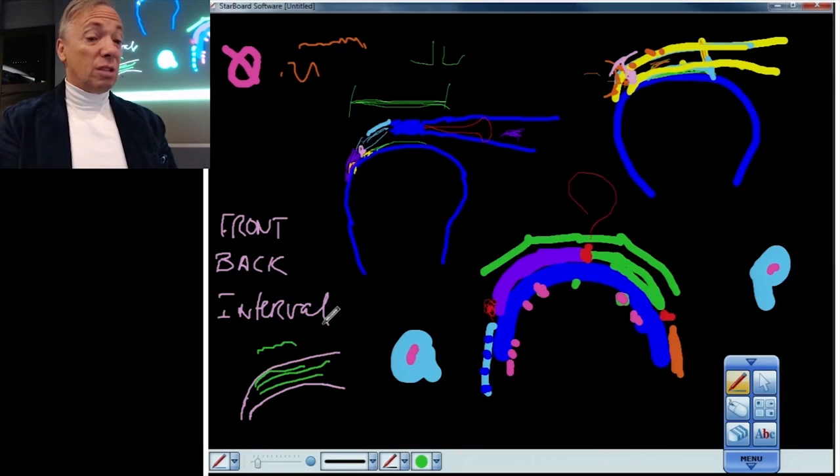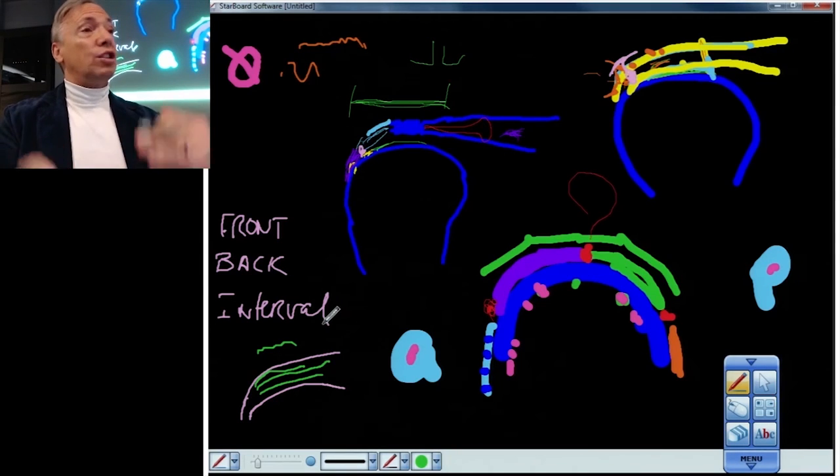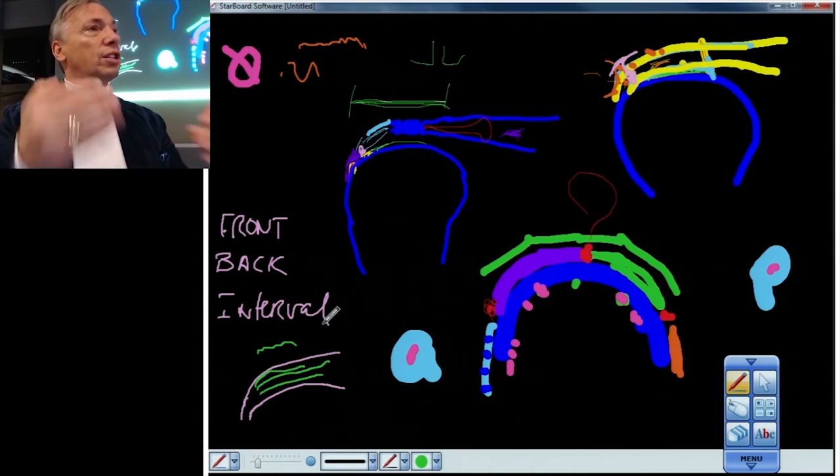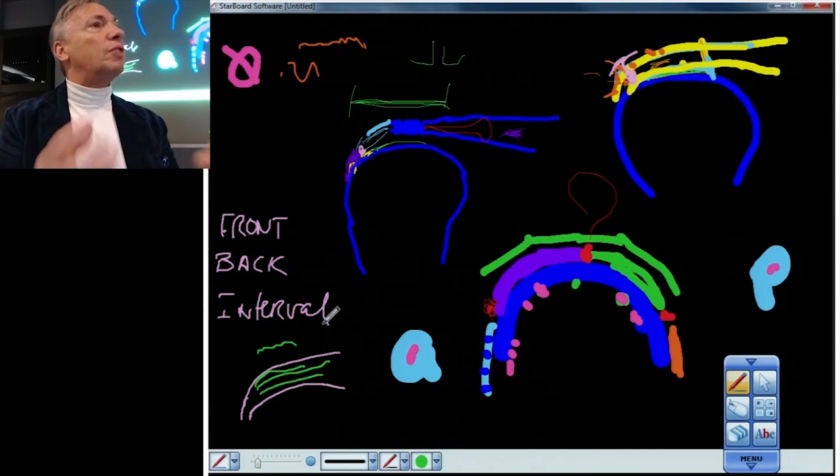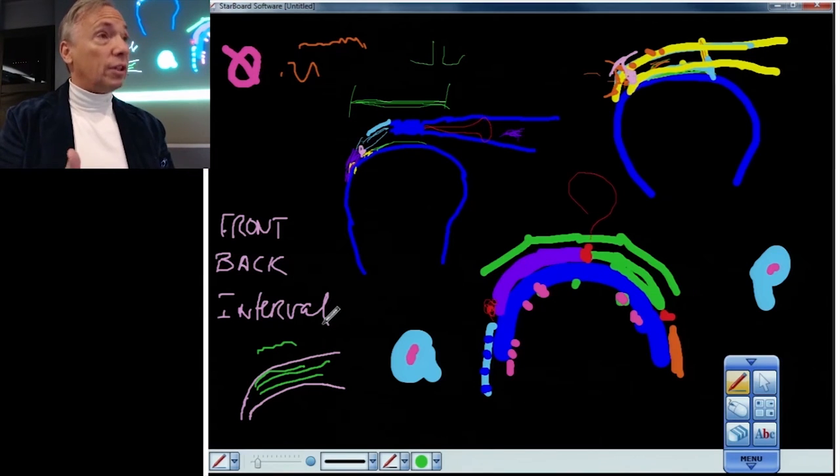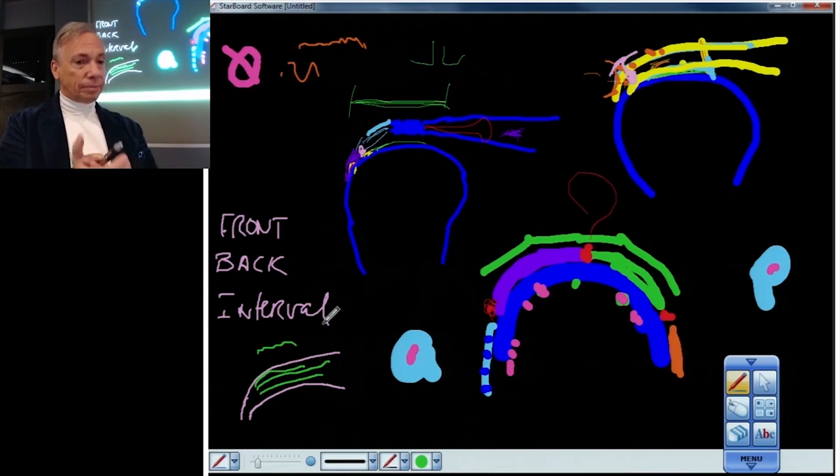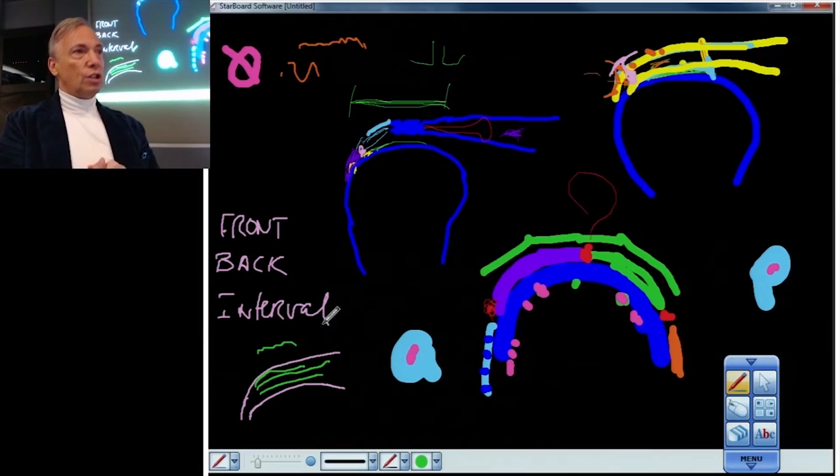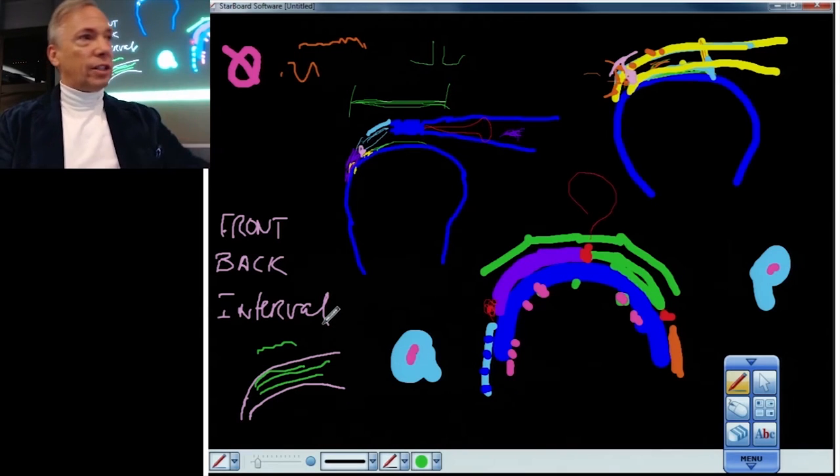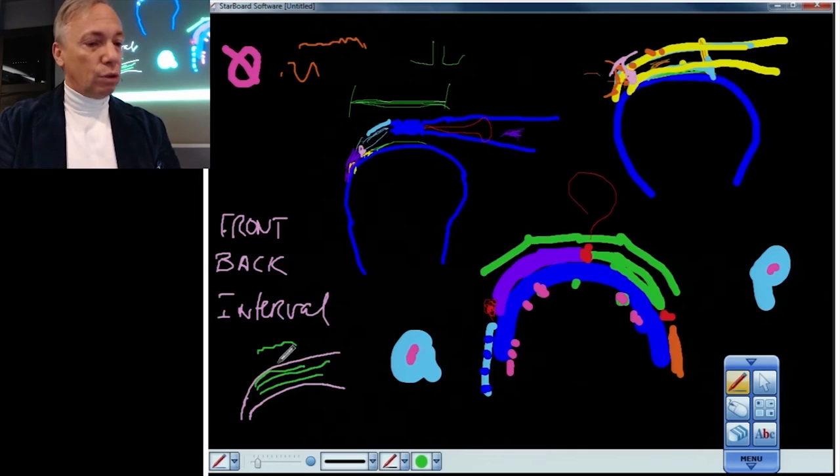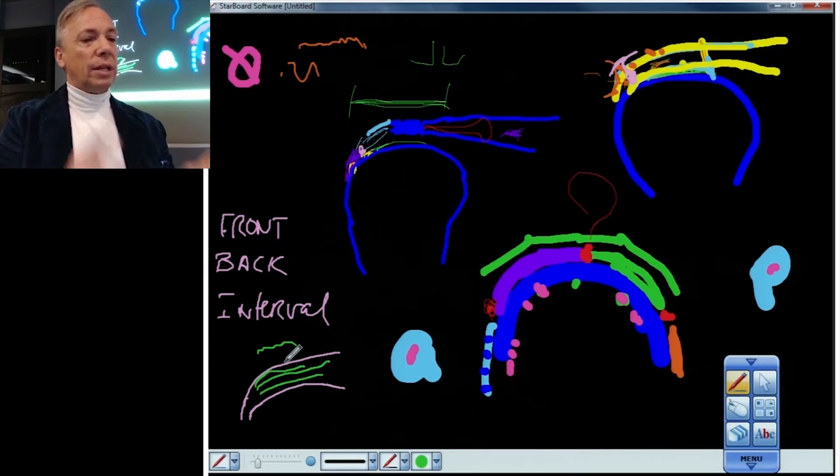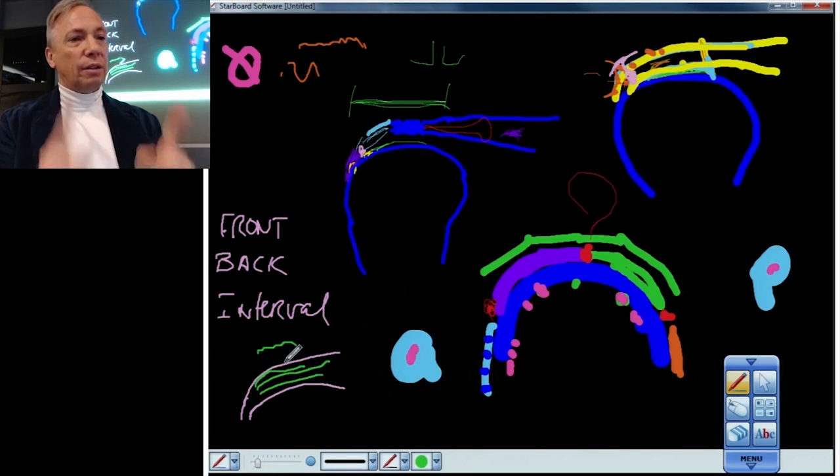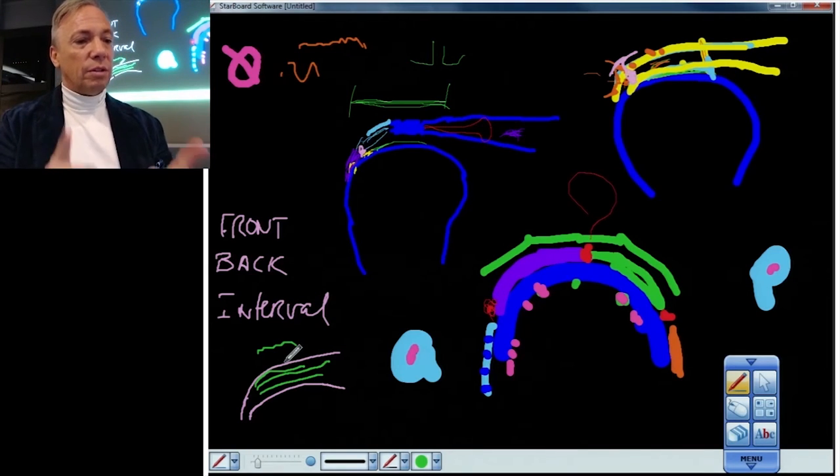That is when I start jumping on the term tendon fiber failure. Which means that the cuff is degenerating, it's swollen, it's inflamed. And I am missing some of the internal anatomy. And there's often irregularity of the humeral head. So when things look very messy, like someone stirred the pot inside the cuff and you lose the internal anatomy, that's when tendon fiber failure becomes very important.